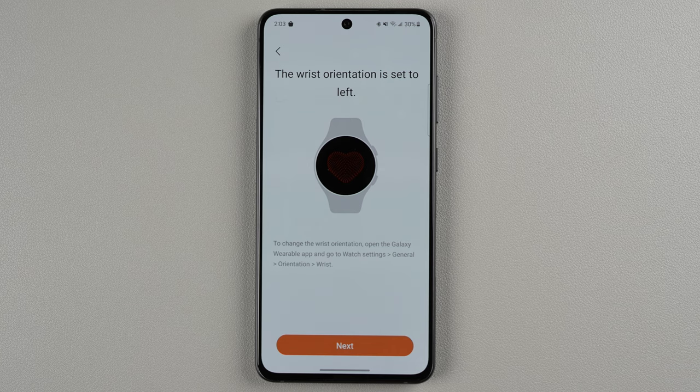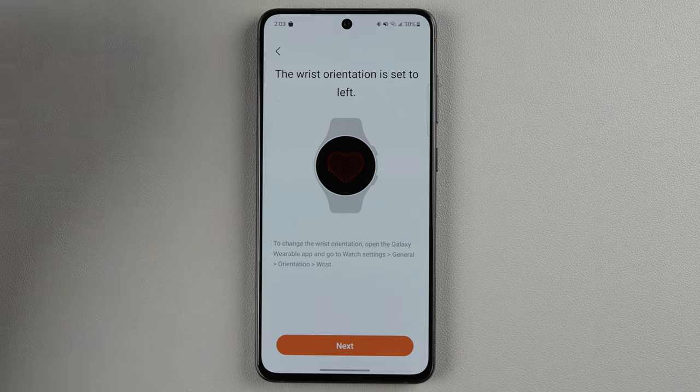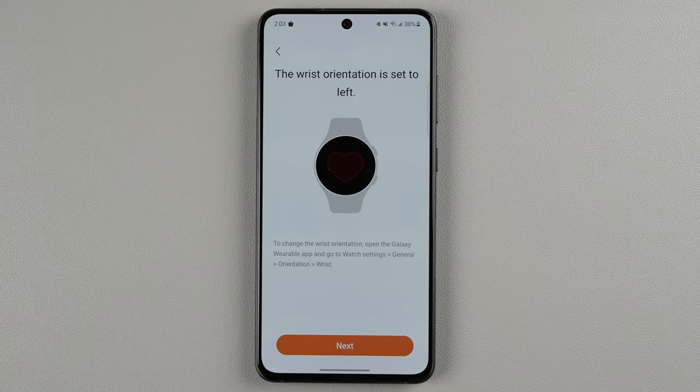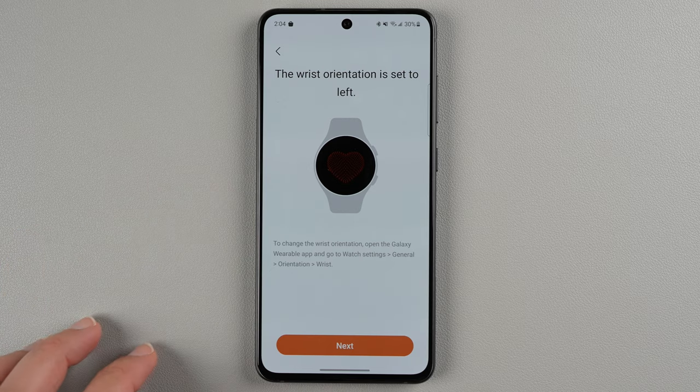Notice that my wrist orientation is set to left, and I do have it on my left wrist. If you need to change your wrist orientation, you can go to the wearable app and go to the settings to change it. If it's correct, you can go ahead and tap next.